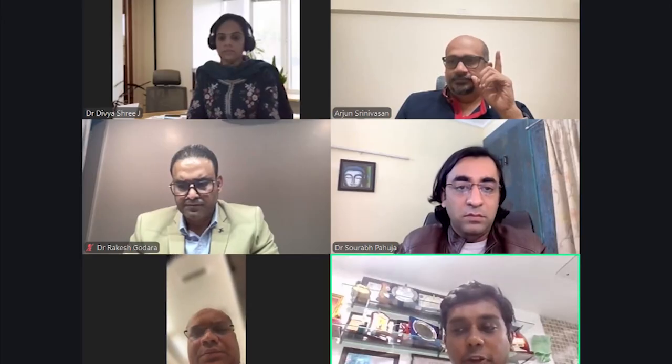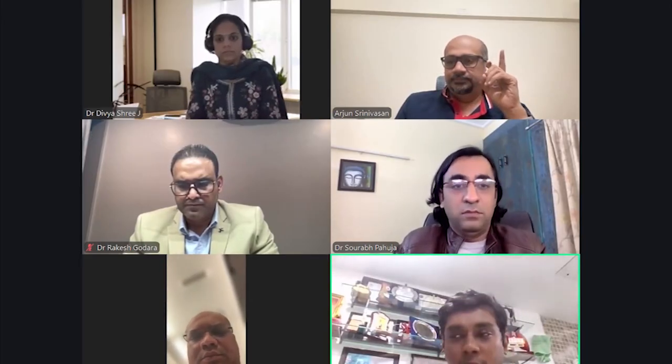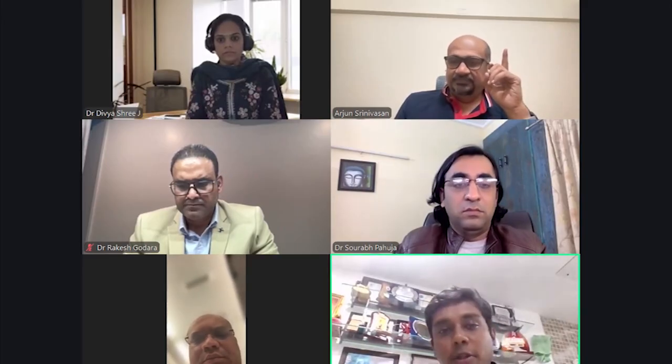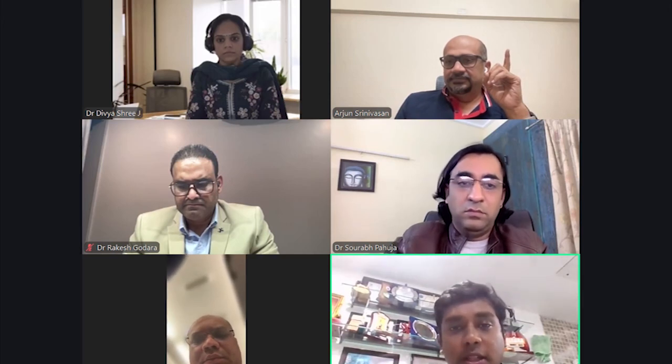Yeah, excellent points, Dr. Saurav. And if it is a carcinoid, don't get excited and jump in and start doing it. And a rigid bronchoscope should always be there, especially when you are attempting to take biopsies or do a tumor debulking of these patients. And I think Dr. Arjun sir has a point to say.